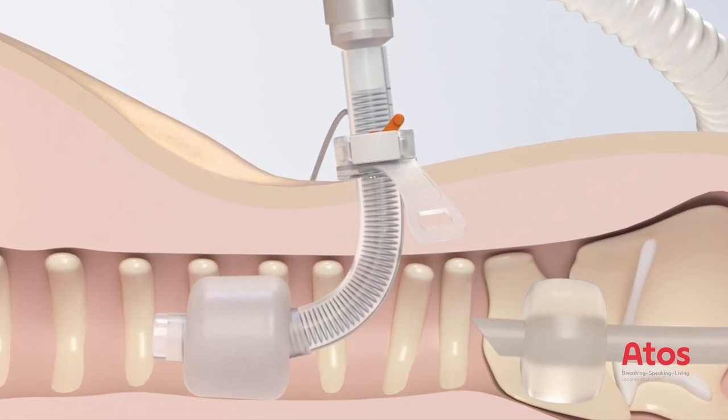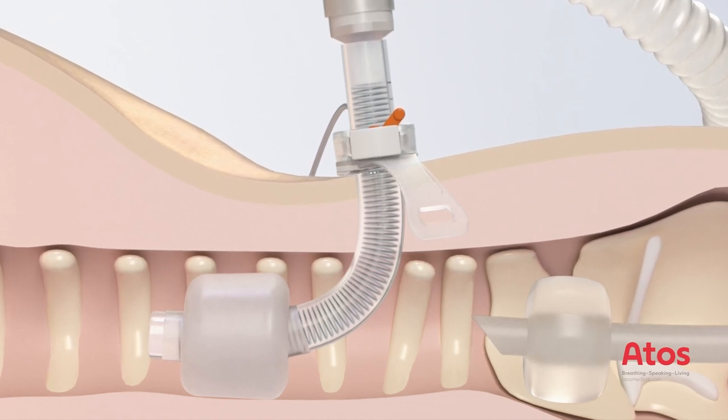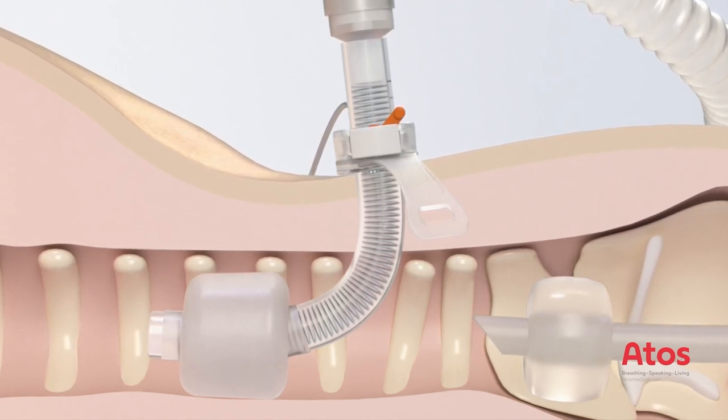Then lock the adjustable neck flange by pushing the orange lever upwards. The cuff of the ET tube is then deflated, withdrawn, and removed under control of the anatomical structures. The ventilation parameters must then be adjusted.